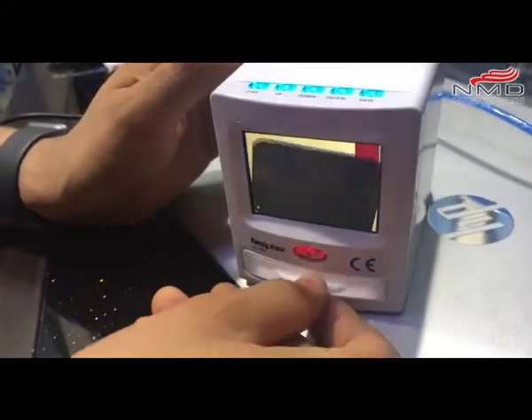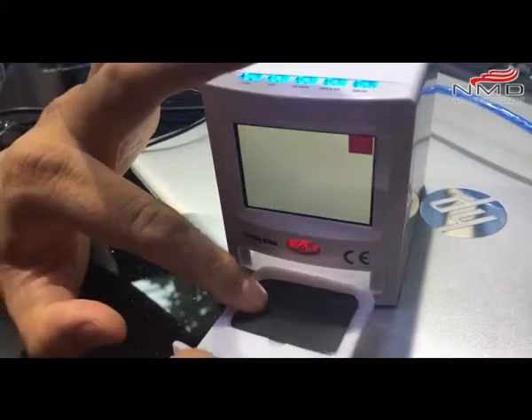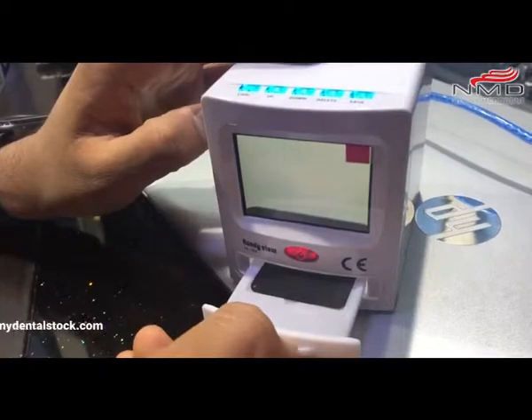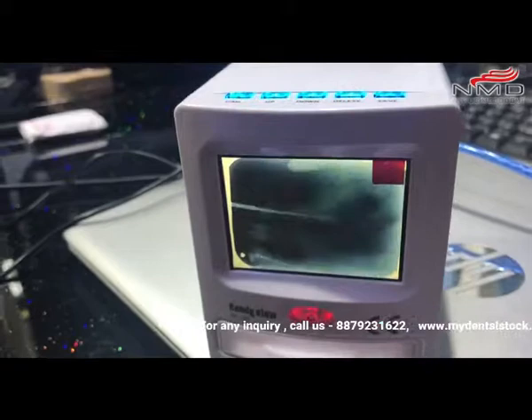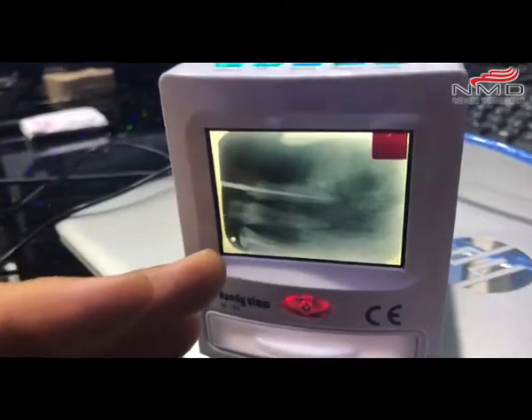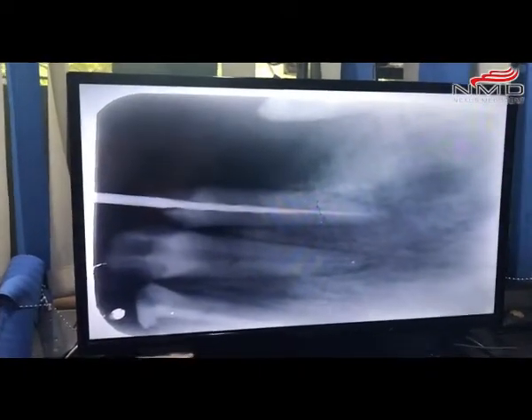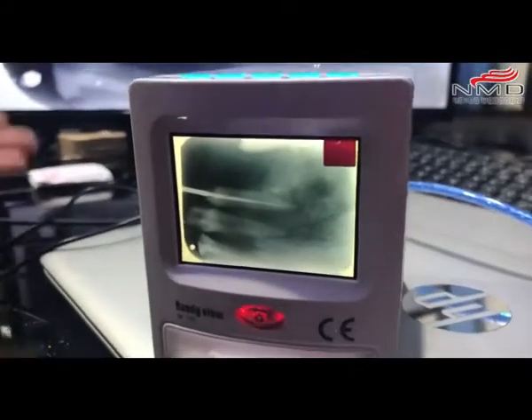The X-ray film wasn't placed properly, so I'm just going to position it correctly — there we go. You can see an image on the device, and I've also connected it to my TV so I have a bigger image as well. I can store the X-ray film data to my computer.